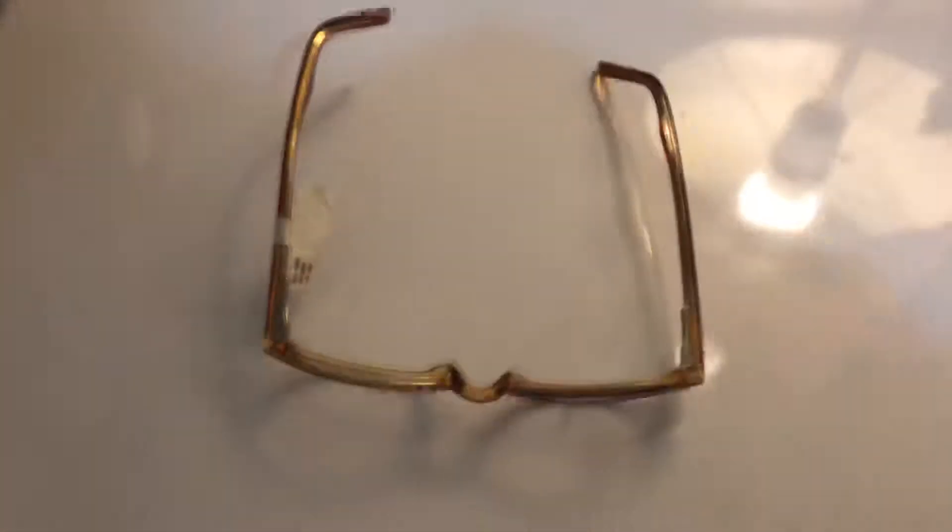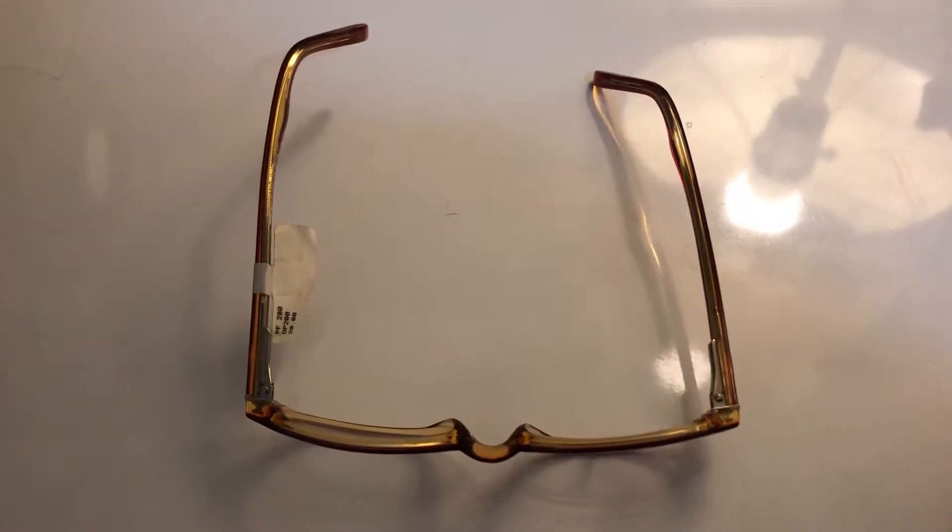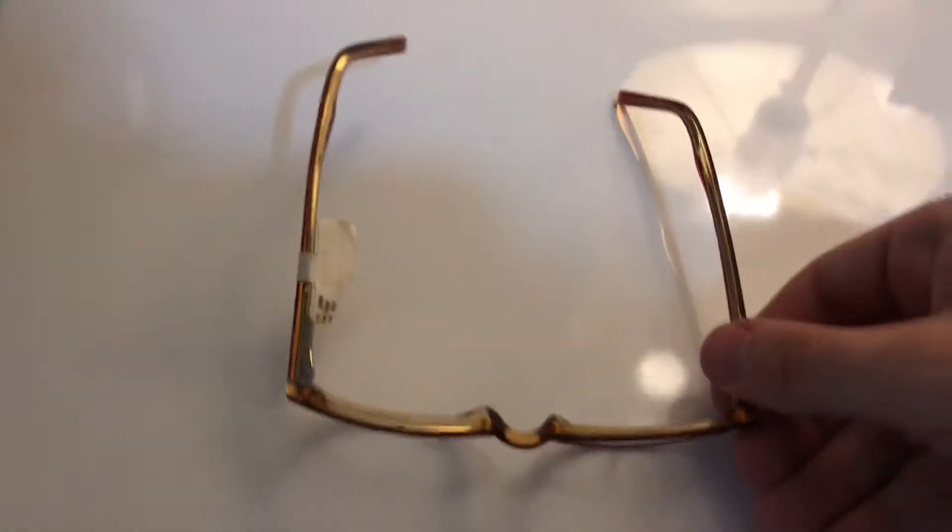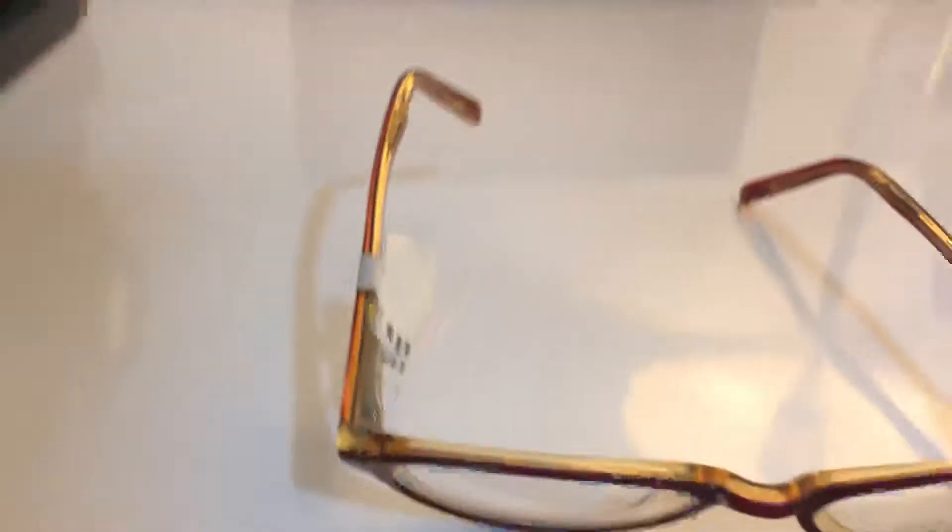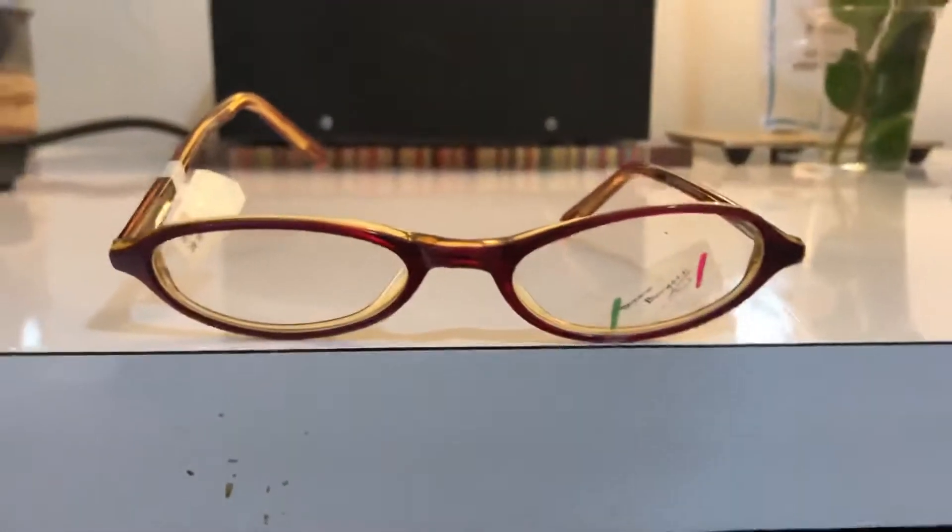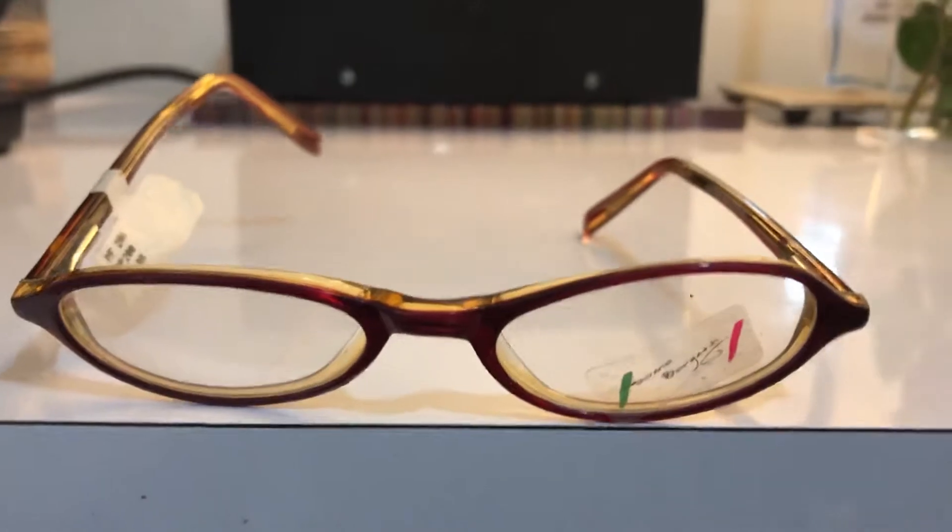So I'm going to adjust these glasses. The first thing that we do to start with is the bridge. So I'm going to bring it to the edge of the table. As you can see, these glasses both don't reach the edge at the same.